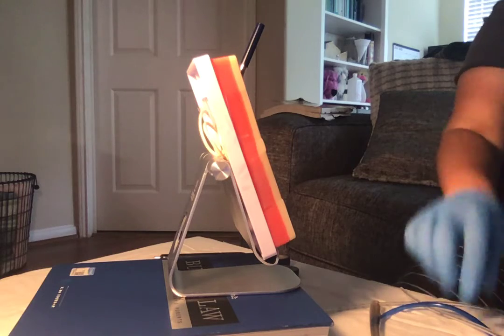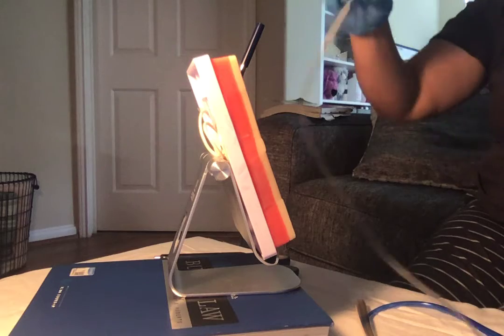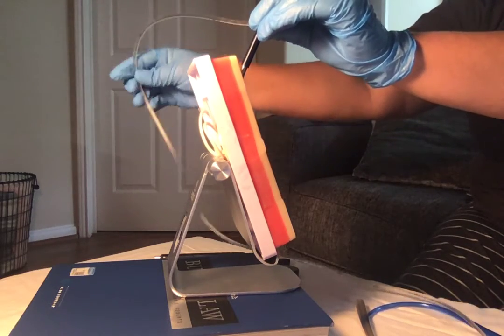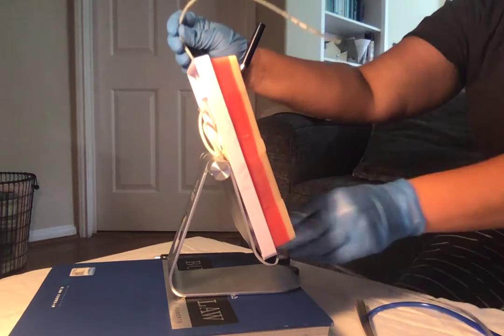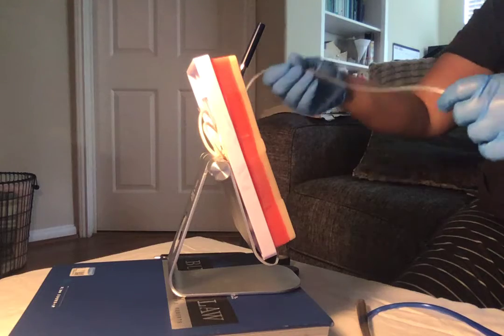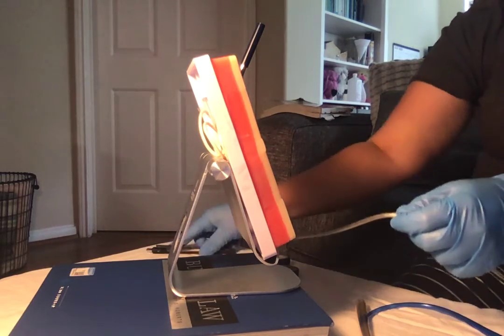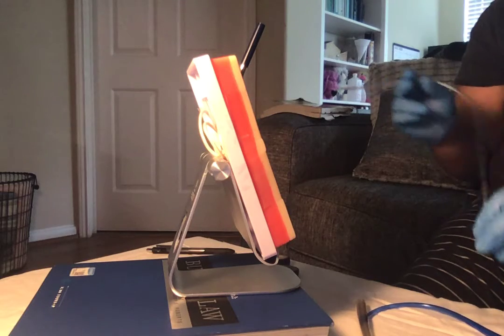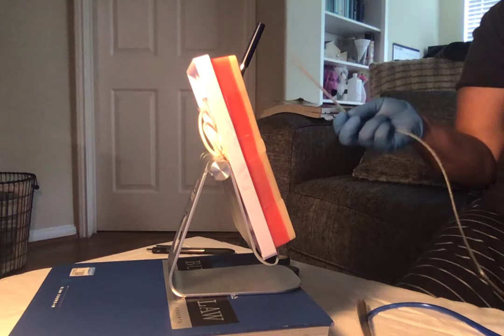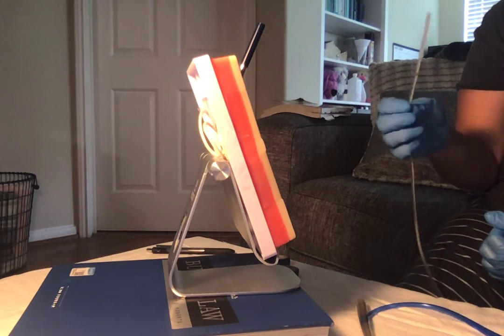I am going to measure the estimated length of the tube to reach the stomach. I'm going to measure from the tip of the nose to the ear to the xiphoid process. For this demo, I will be using 45 as our marker. I'm going to put the distal end of the NG tube in some water-soluble lubricant and place a towel on the patient's chest.